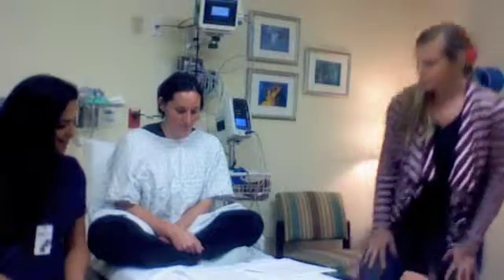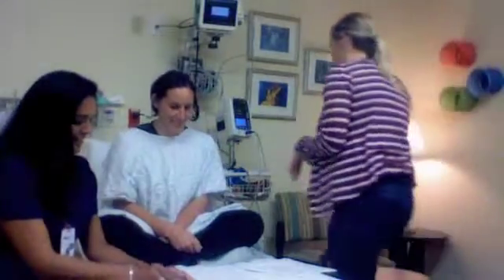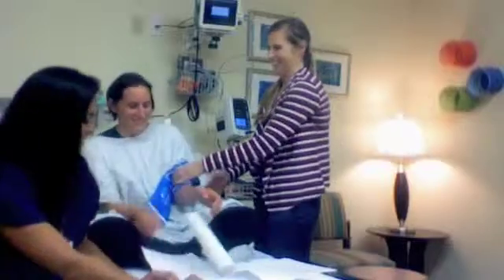Let's first discuss the wrong way to go about taking Jessie's blood pressure. Hi Jessie, we need to get your blood pressure. I'm gonna put this on your arm, and it's gonna squeeze your arm, okay? It hurts. When school-age children hear the word squeeze, they may think the worst, such as this image.